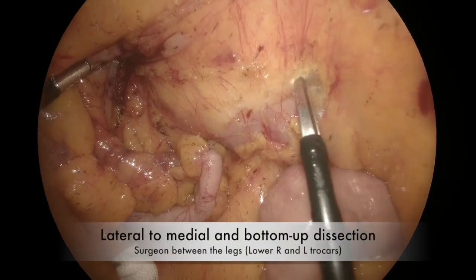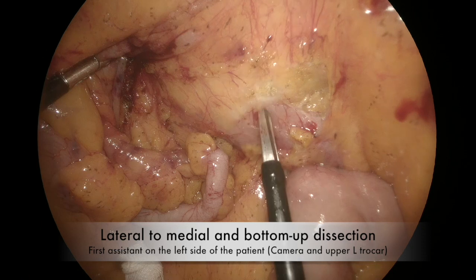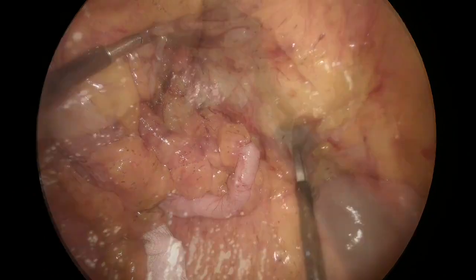Surgery started at the duodenum according to a bottom-up lateral-to-medial dissection. The surgeon stands between the legs. D2 and the head of the pancreas were carefully dissected.